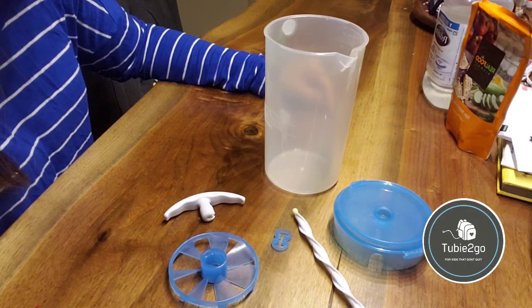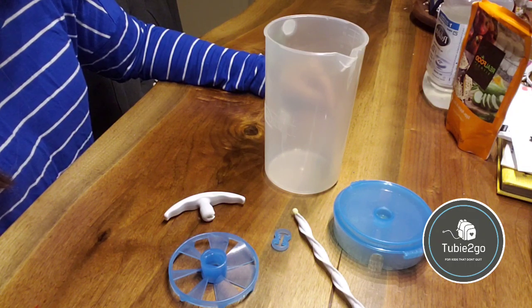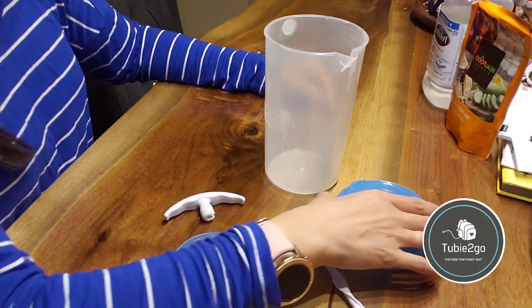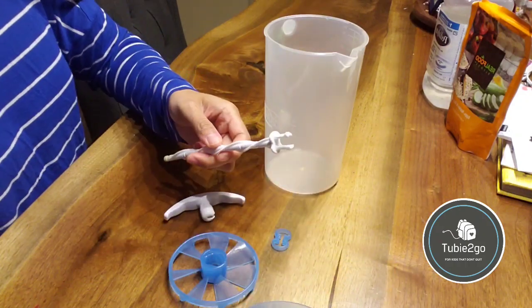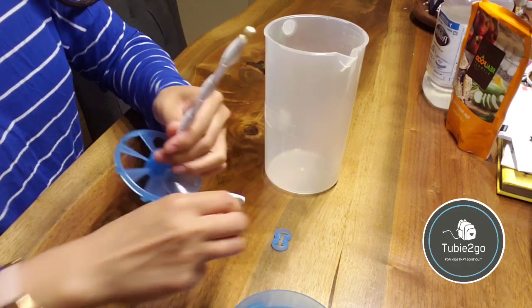I keep it stored in the pitcher in between feeds until I'm ready to pour out one bottle's worth. The pitcher is very simple to assemble, and I will show you just how simple it is — it comes in several pieces, which makes it easier to wash.